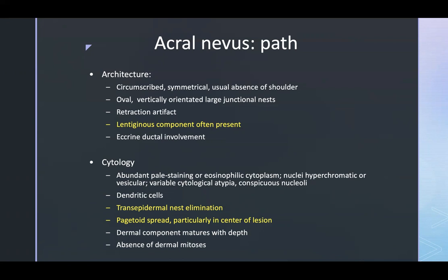And PRAME, it was just kind of a lucky cohort, I guess, because PRAME was 100% positive in melanoma, and it was 100% negative in benign nevi. The cutoff threshold was 75%, but the benign, Spitz, and dysplastic nevi essentially had extremely negligible detection of PRAME, whereas the acral melanomas, going from acral melanoma in situ all the way to the very large nodular acral melanomas, were all very diffusely and darkly positive for PRAME in the nucleus. Way greater than 75%, probably close to 100% of the melanocytes.